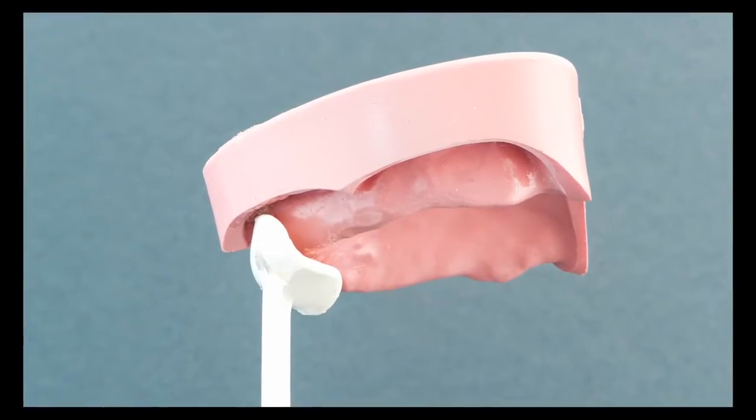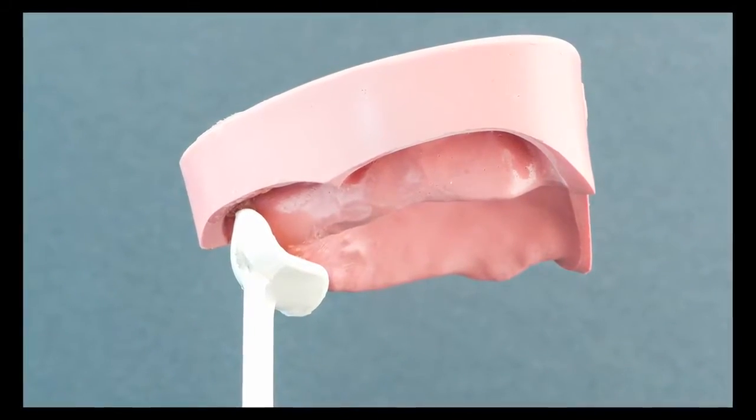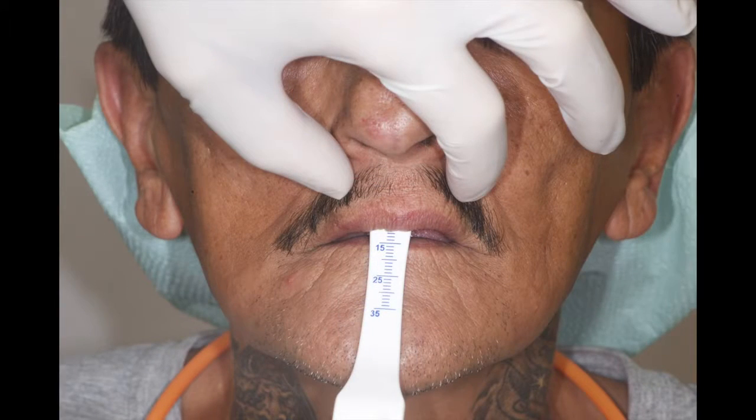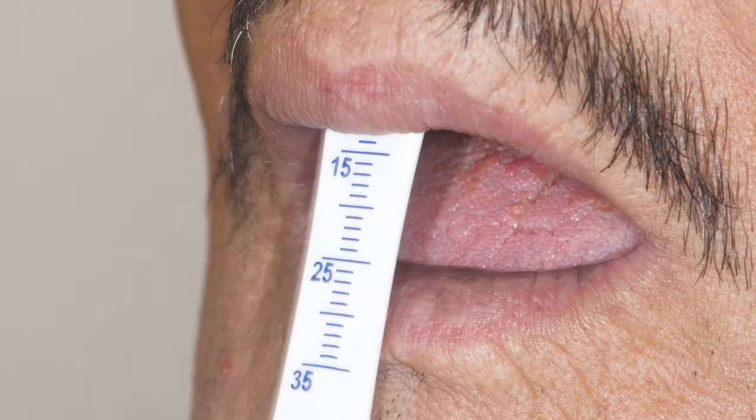Place the cupped edge of the Avameter onto the patient's incisive papilla. The instrument should be positioned parallel to the patient's facial midline. Ask the patient to relax his or her lip. This may take coaching with some patients. Record the length of the upper lip in millimeters.